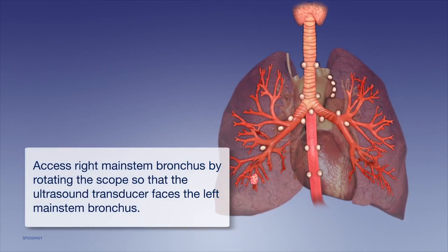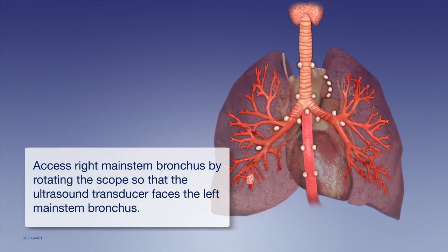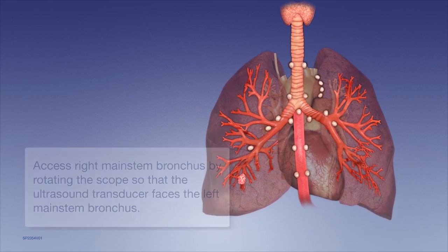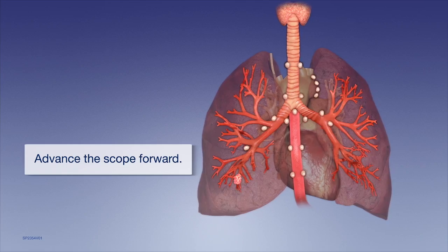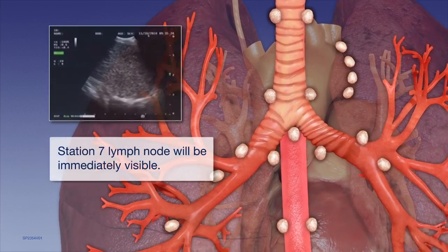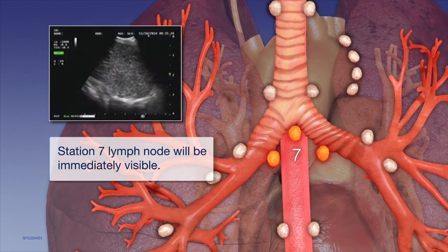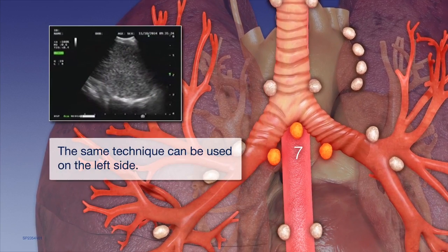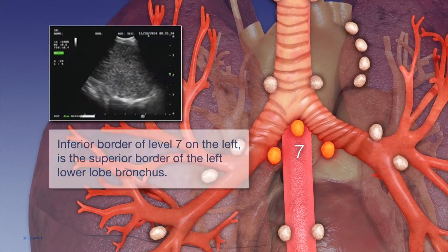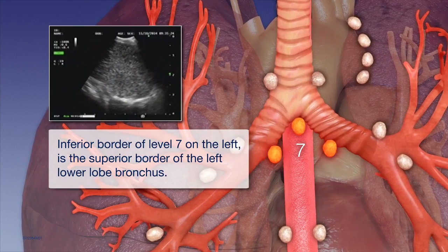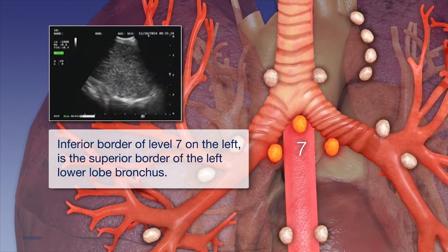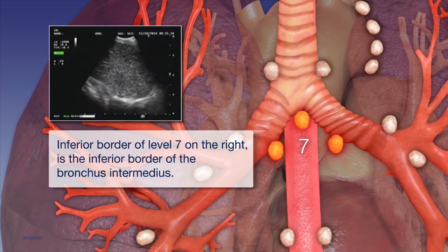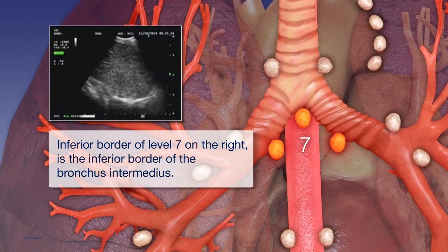Access the right mainstem bronchus by rotating the scope to face the left mainstem bronchus and then advancing. Using this technique, the Station 7 lymph node will be immediately visible. The same technique can be used on the left side. The inferior border of Level 7 on the left is the superior border of the left lower lobe bronchus, and on the right side is the inferior border of the bronchus intermedius.